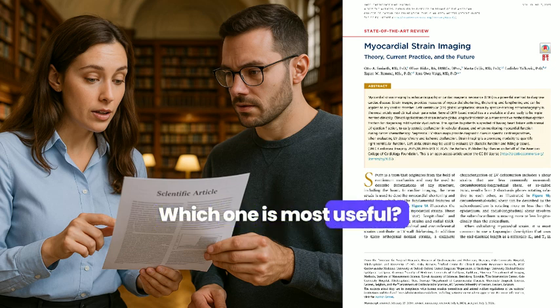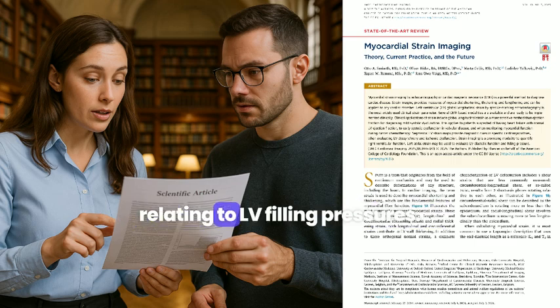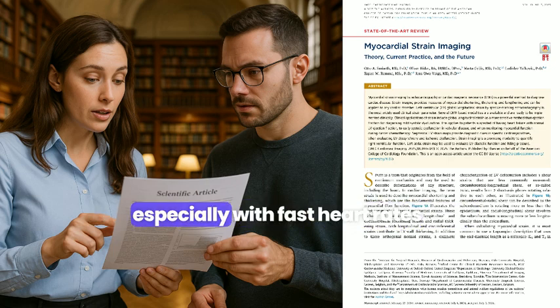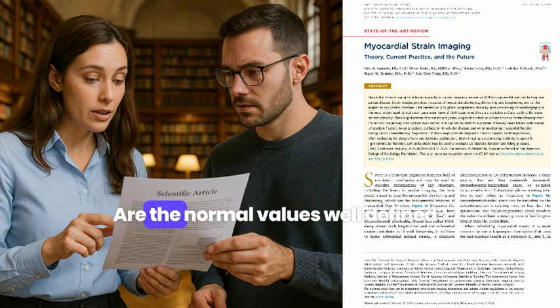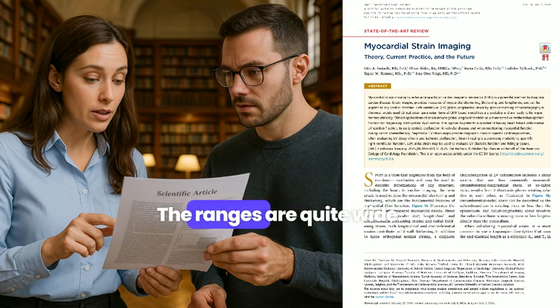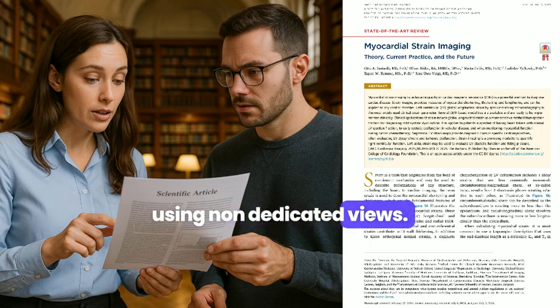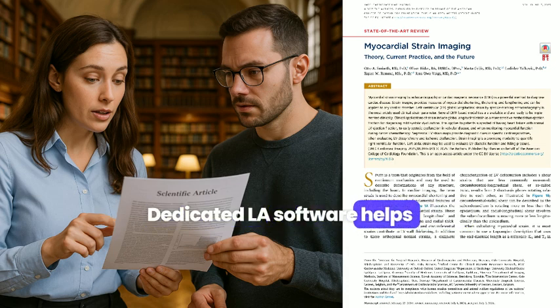Which one is most useful? Reservoir strain probably has the most data behind it, especially relating to LV filling pressures. Pump strain gives info on LA contractility, but can be tricky to measure, especially with fast heart rates, and it's obviously absent in atrial fibrillation. Are the normal values well defined? The ranges are quite wide, honestly. Biological variability, using non-dedicated views, sometimes manual tracing, adds noise. Dedicated LA software helps reproducibility.